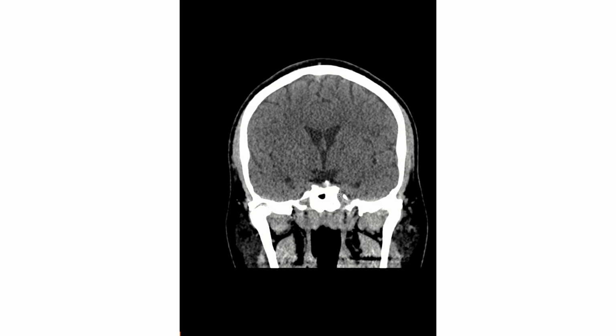And then, as I said, it depends on the indication. We're going to see fractures in case of trauma. There are so many indications for head CT, and this is usually a kind of screening for clinicians to start with, and then they go from there. And if there is any pathology, we decide to do another MRI or other subsequent scans.